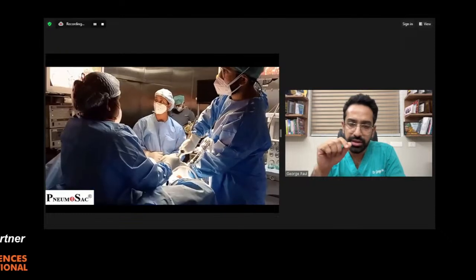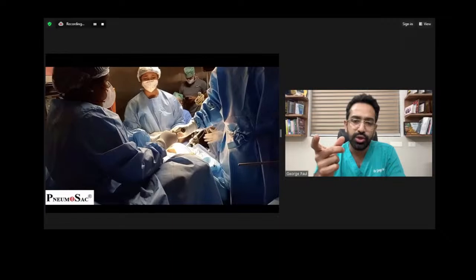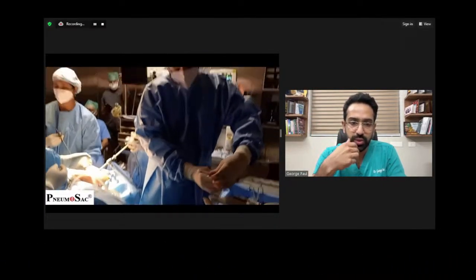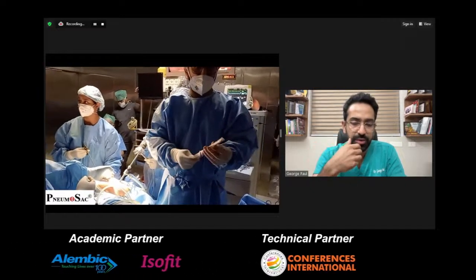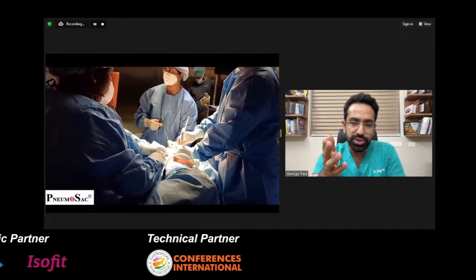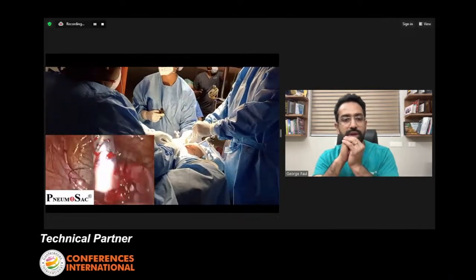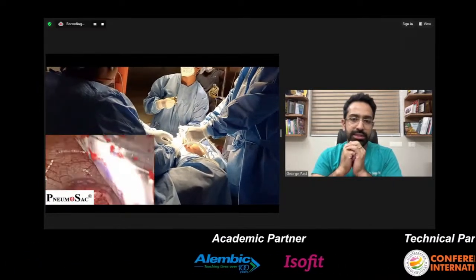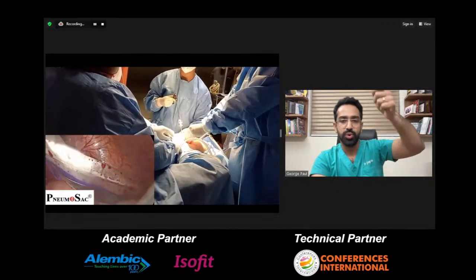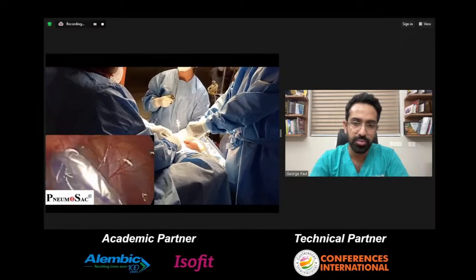I enlarge the wound, use a dilator to dilate it slightly, and nowadays we normally use a 15 or 18 mm morcellator for large myomas. So this is another bag. Introduction is quite easy. I just push it along with its introducer through the suprapubic incision. You can see in the picture-in-picture how it comes inside. Once it is inside, the introducer is rotated anti-clockwise so it loosens up, and you pull out the plastic bit, that is the introducer, and the bag will be completely inside.